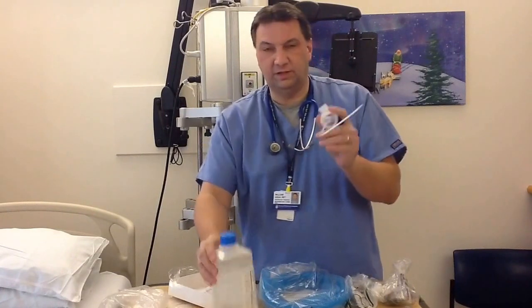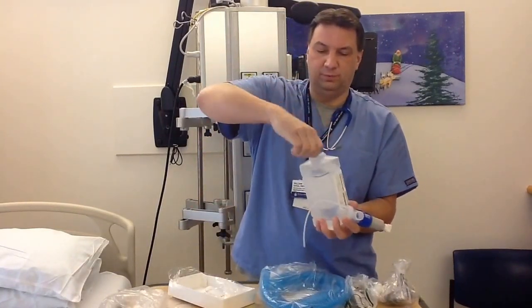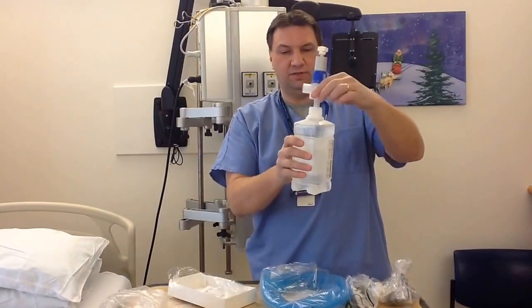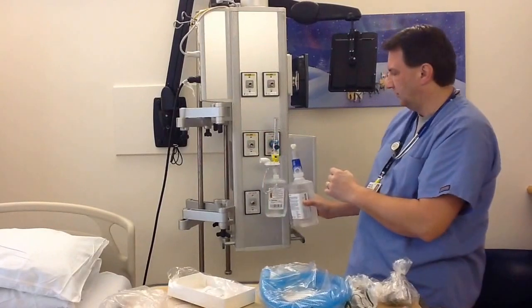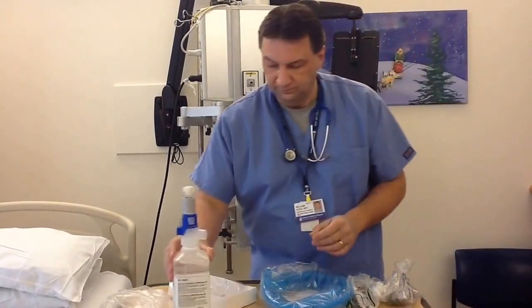And this one's a little bit easier. All we do is twist off the top blue portion, just like that. And we insert the jet portion of it right into the center. And then we twist it on just like that. And then this portion here just screws on to any flow meter, just like this one did.